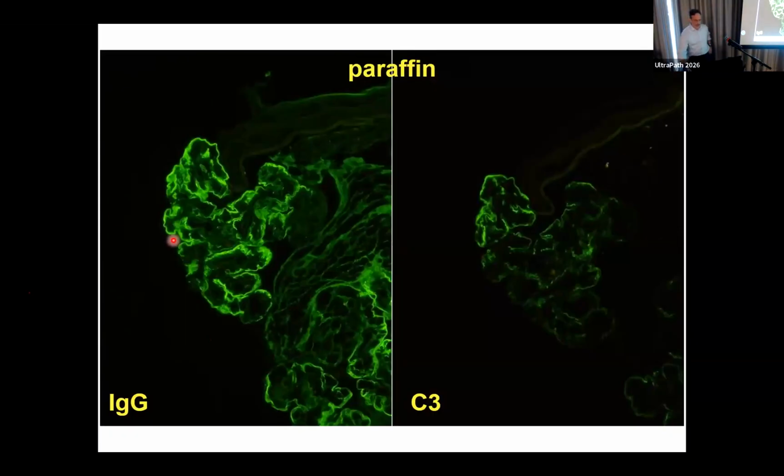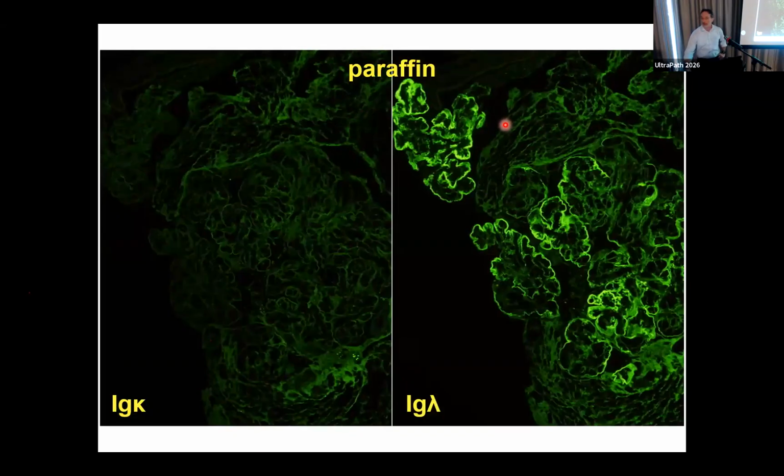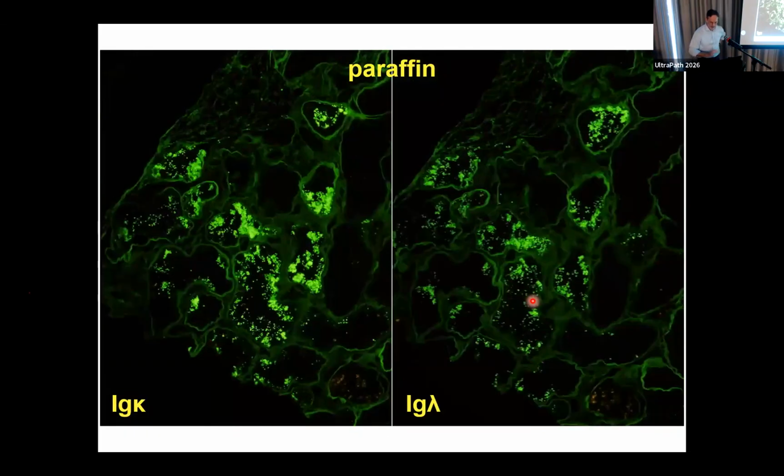The IgG that we see stained here shows a really distinctly linear pattern in many of the glomerular capillaries. Also interesting, it wasn't entirely continuous. It was somewhat discontinuous in some areas that you can see broken up here, but really convincingly linear, I think. The C3 showed a similar pattern, but maybe a bit more discontinuous. There was no C1q, IgM, or IgA, but the light chains that I'll show you here are restricted to lambda. Again, the same pattern of linear staining of these peripheral capillary loops and really no staining for the kappa. And this just shows you that both stains actually work.